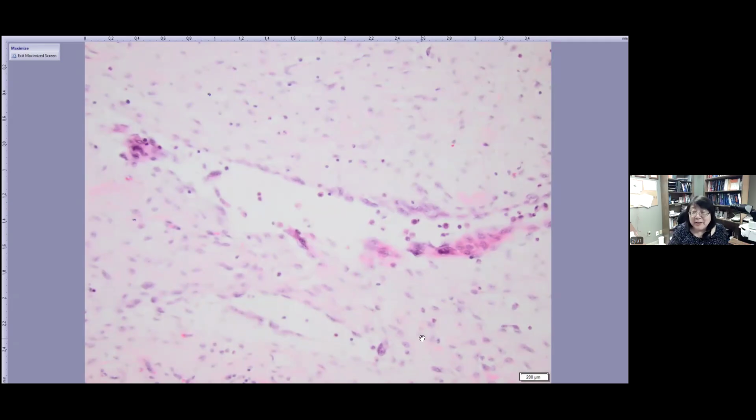Before I tell you another immuno, let me know if you have any differentials now.